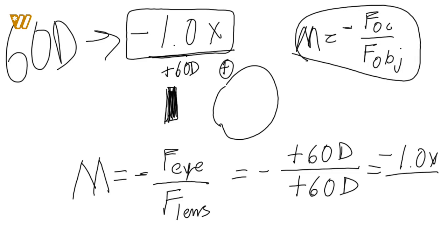So what that means is that whenever you measure the optic nerve with a 60 diopter lens and you look at your slit lamp and you look at the actual height of your slit lamp beam, that'll tell you the exact height of the optic nerve.